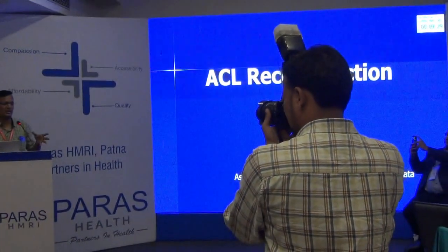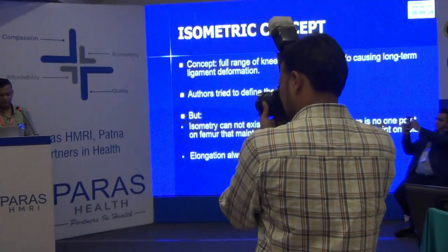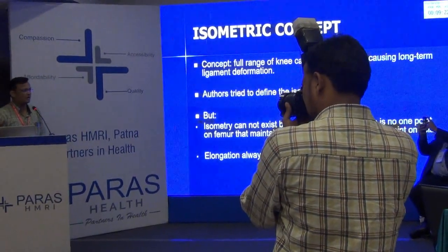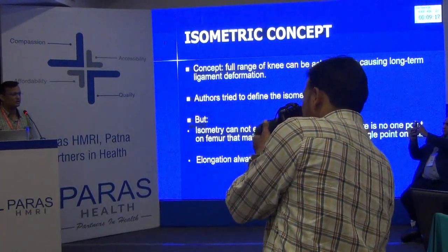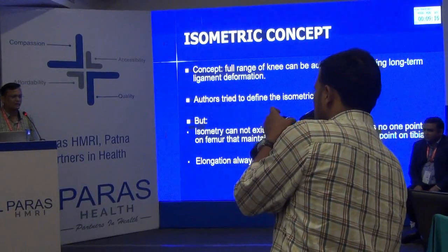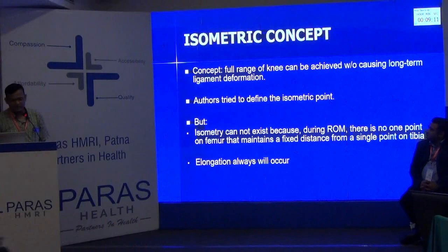I think for ACL reconstruction, Arvind told me to show one or two cases, but I think we all know that the majority of us are doing single bundle ACL reconstruction. Very rarely, I think probably Deepak Sudhir is the only one who is doing double bundle in India, and 99.99% of people are actually doing the single bundle.